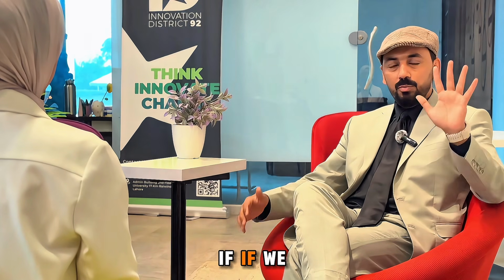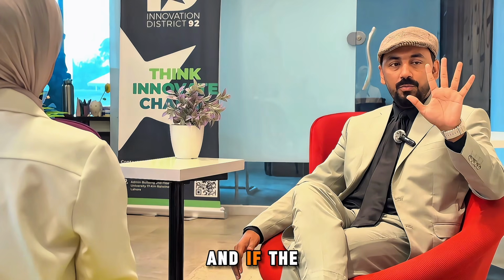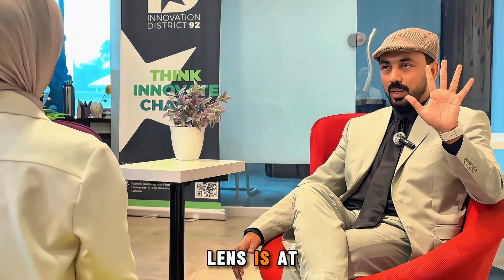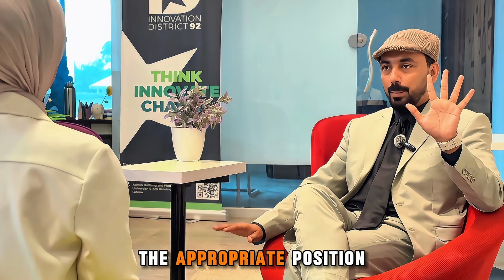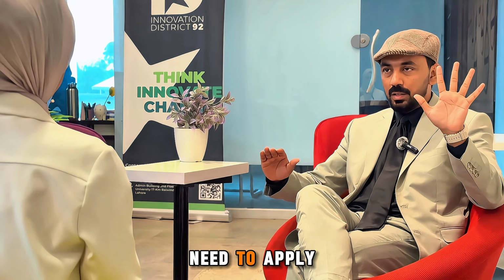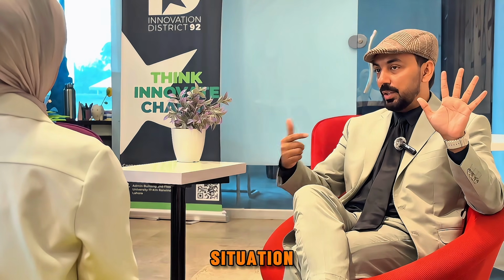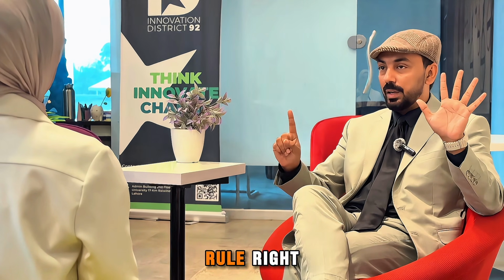What I said is, if we insert a toric contact lens, and that lens is at its 6 o'clock position, the appropriate position, and when the patient blinks, the lens somehow rotates and comes back to the original position, it means there is no need to apply the LARS rule. So this is the contraindication. In this situation, we will not apply the LARS rule.